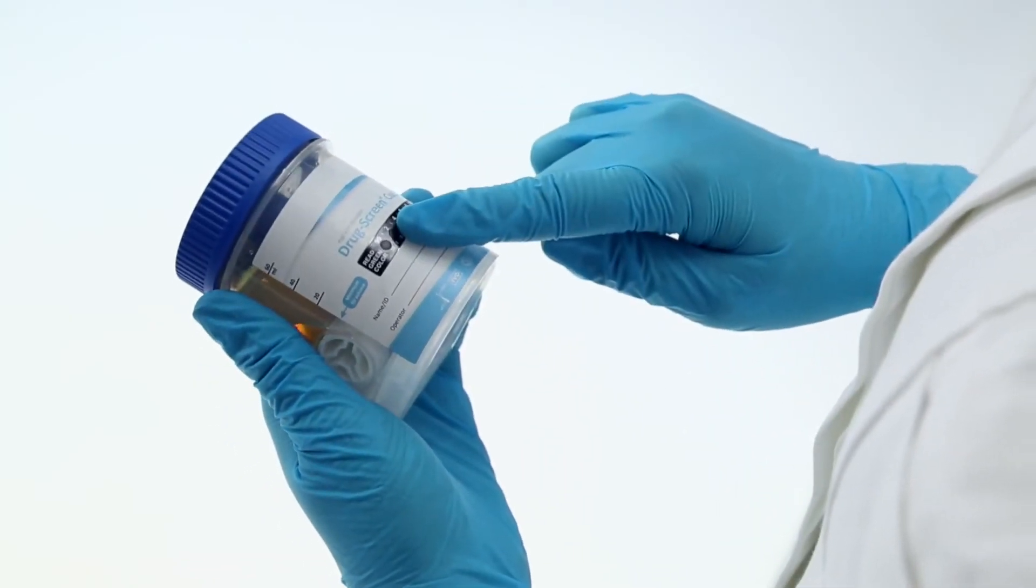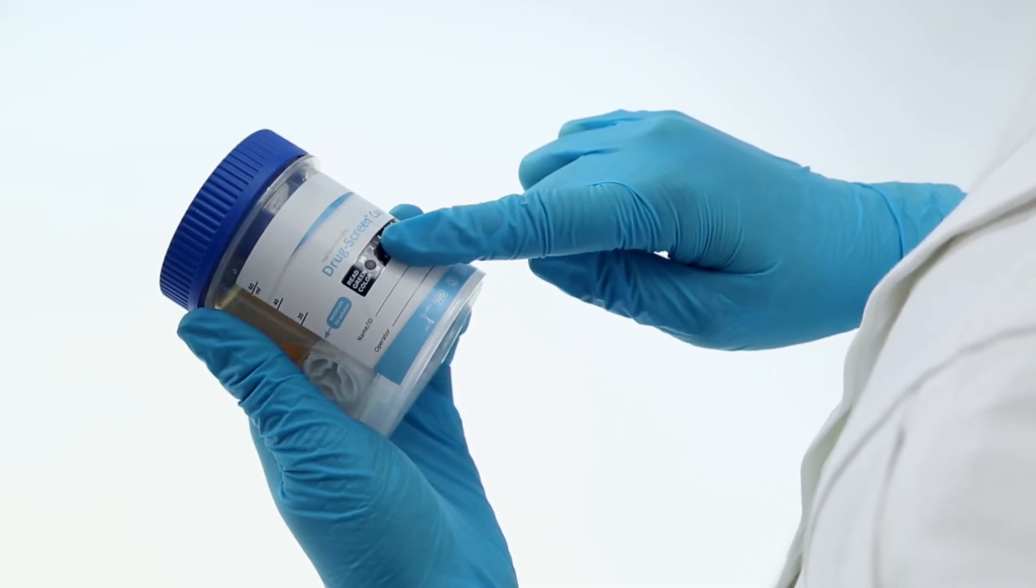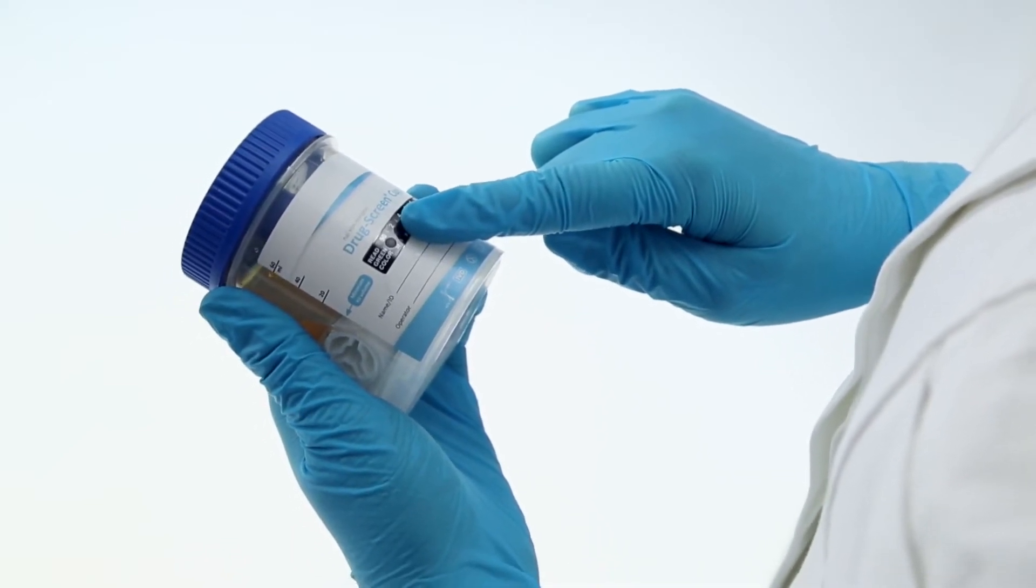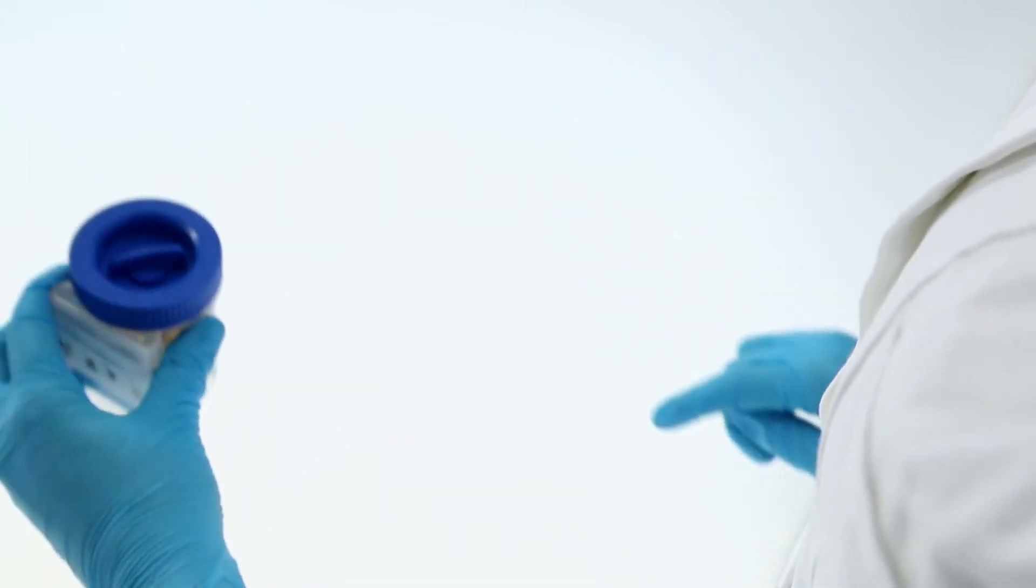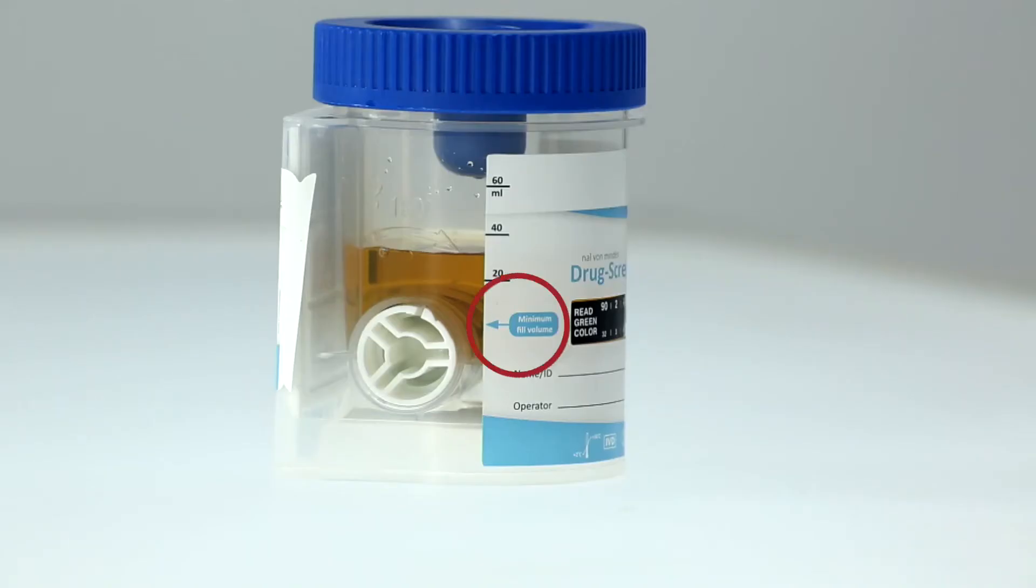Temperature strips integrated into each test indicate where the samples are fresh, that is 32 to 38 degrees Celsius or 90 to 100 degrees Fahrenheit. The minimum fill volume is also marked on the test, but readings are most reliable when the sample volume exceeds 20 milliliters.